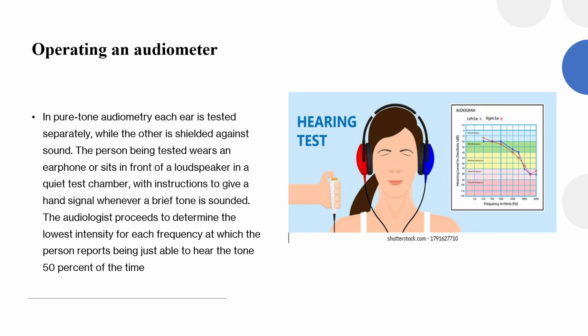Operating an audiometer. In pure-tone audiometers, each ear is tested separately while the other is shielded against sound.